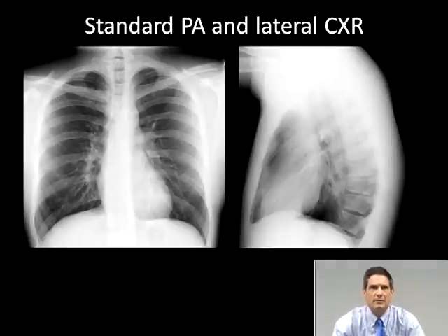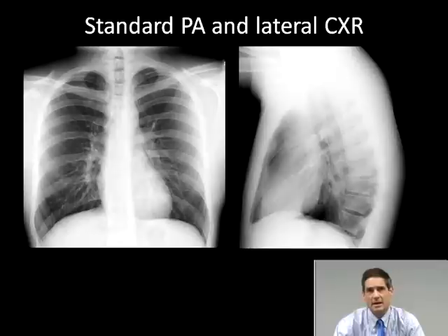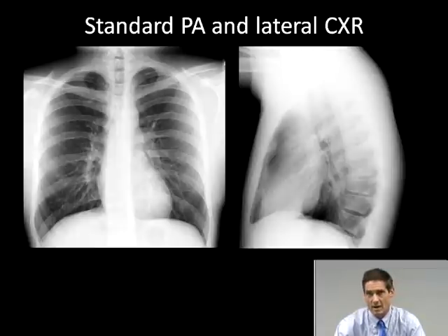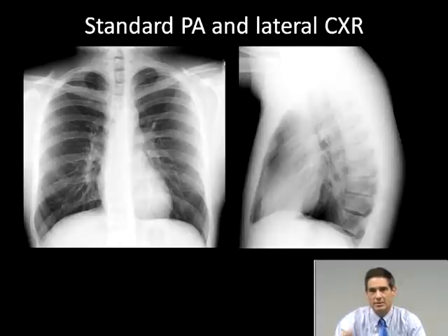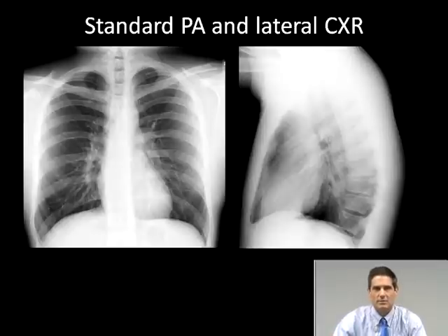Here's an example of a standard PA lateral chest x-ray of a nice young person. On the PA, the heart size is less than half the transverse diameter of the thorax. On the lateral, the vertebral bodies become less white — more gray or black — as you go from top to bottom. Both posterior costophrenic angles are seen nicely, though the photograph may have compressed the image slightly compared to the native chest x-ray.